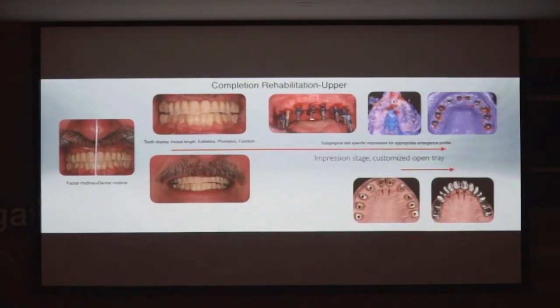So what we're doing, he's again using the same technique. He's gotten the soft tissue contours with his temps. He's going to pick them up with GC pattern resin inside these through the tray. He cuts a groove through this tray and puts wax in there, and then he just pushes all these right through the wax. He doesn't have to cut holes, and it all doesn't come out. It's a great idea. So these are your custom abutments, and there's the framework.